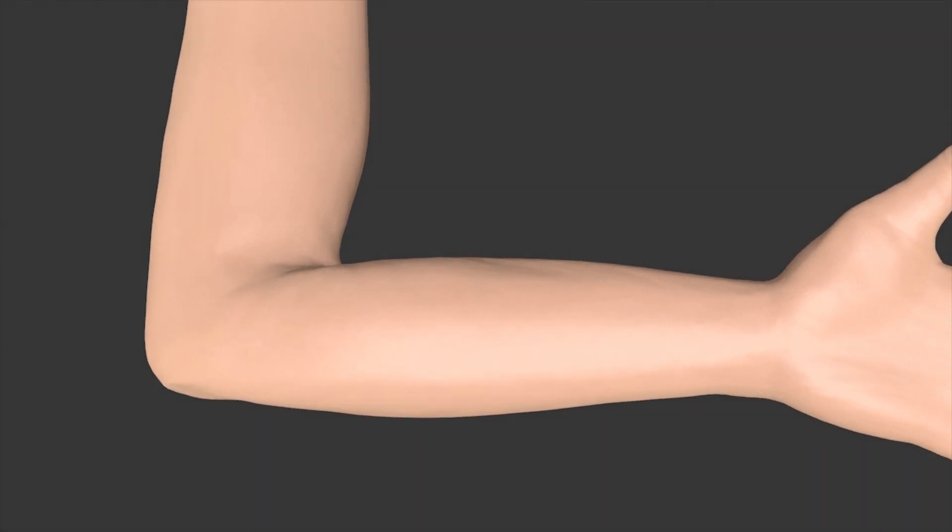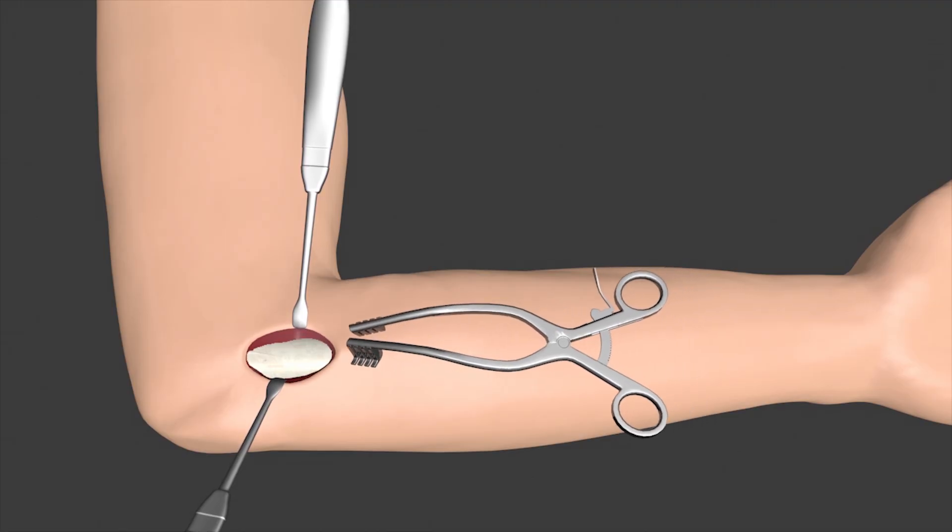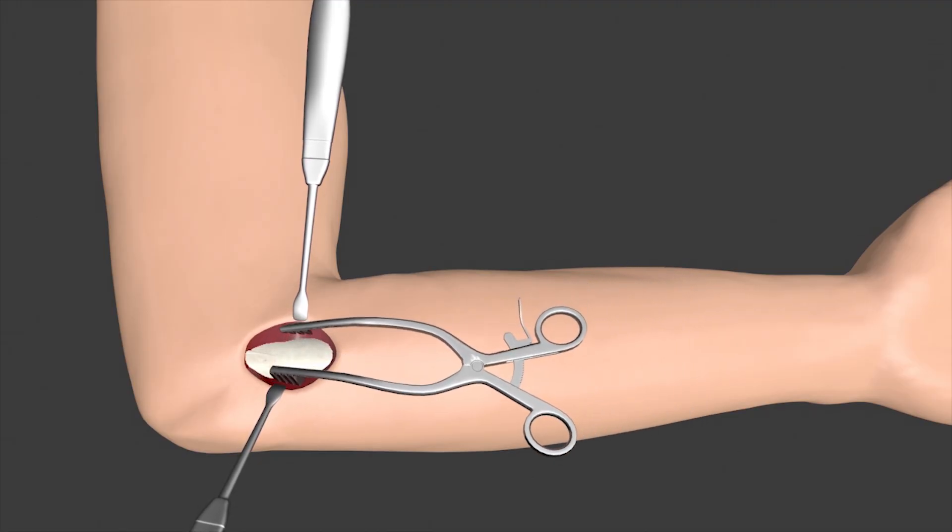Oftentimes, a surgeon will draw on the arm, noting where the incision will be made, and to avoid the ulnar nerve, which is identified with a dashed line. In this simulation, we'll assume the UCL is torn away from the humerus.